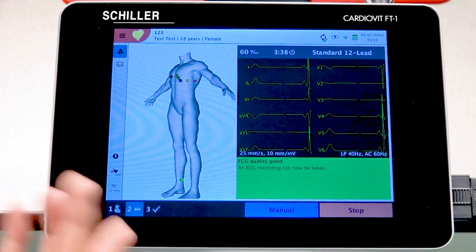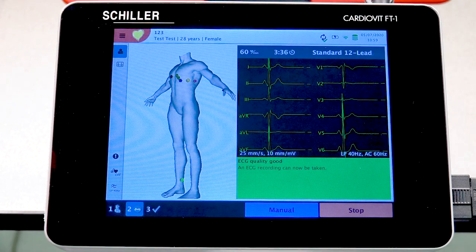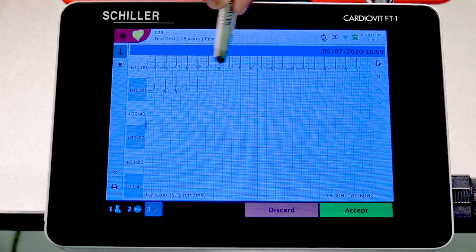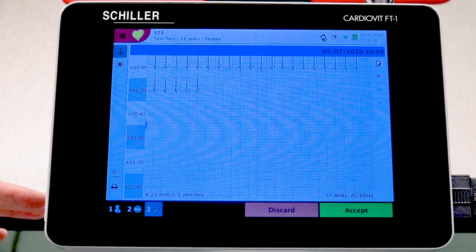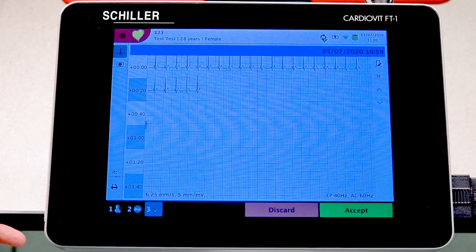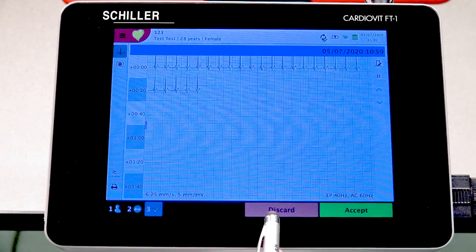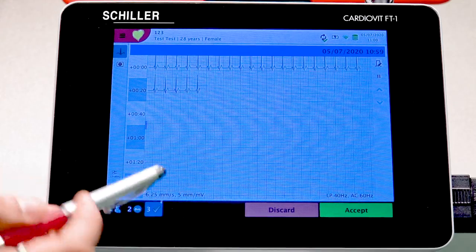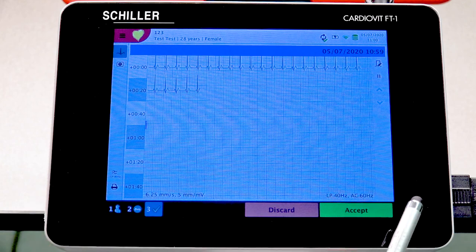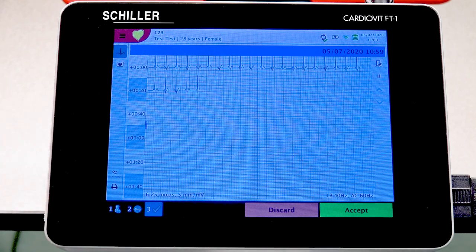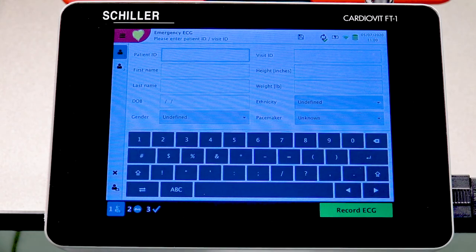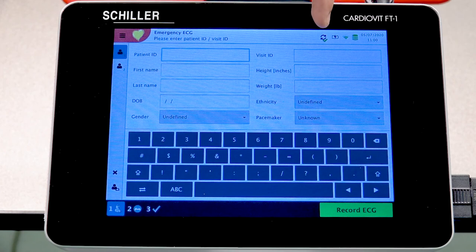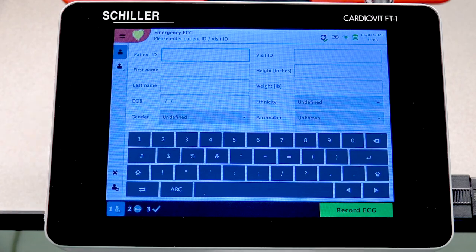If you choose to press Stop, the unit will take you to the next screen showing what was recorded. Similar to the auto resting ECG, you have the ability to discard if it's not acceptable, or to accept, as well as printing and selecting filters. Let's press Accept — confirming it's saved to internal memory and successfully transferred to the server.